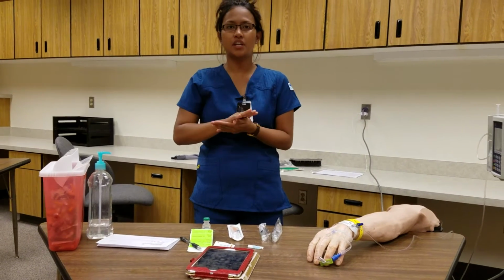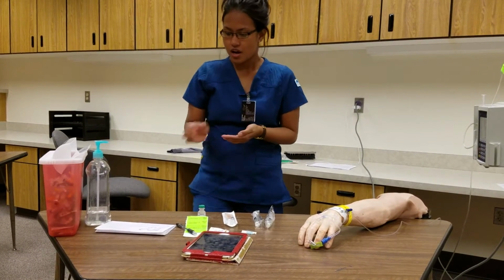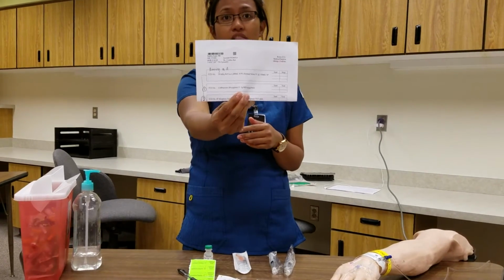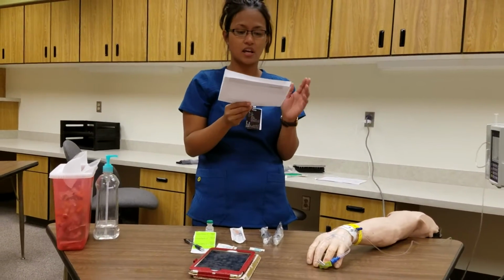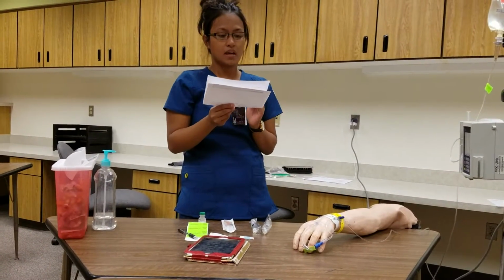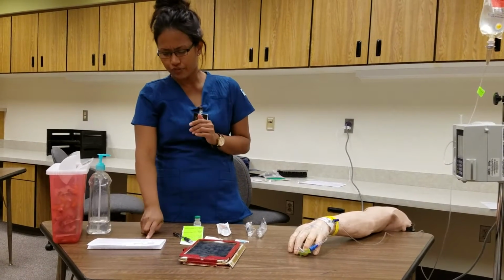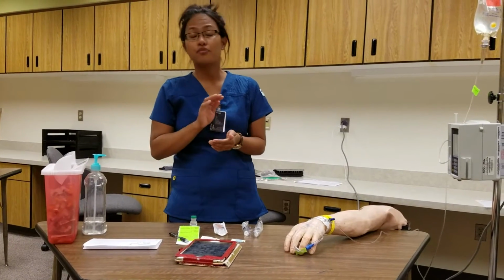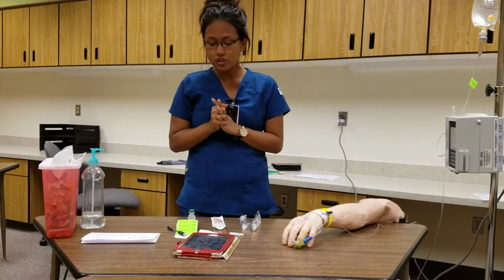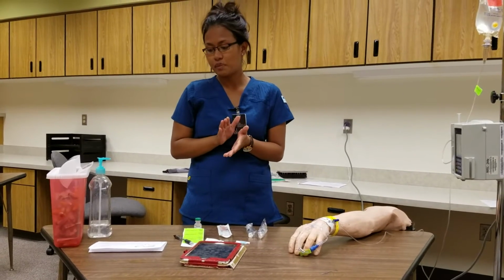Okay, today I will be taking care of Miss Sandra Jones, and I received an order from her provider. I'm looking at my MAR, and right now I determine that Miss Sandra Jones has 150 ml normal saline running per hour with 20 milliequivalent potassium chloride, and my provider's order is morphine sulfate 2 milligrams every 4 hours for pain. Actually, that's PRN.